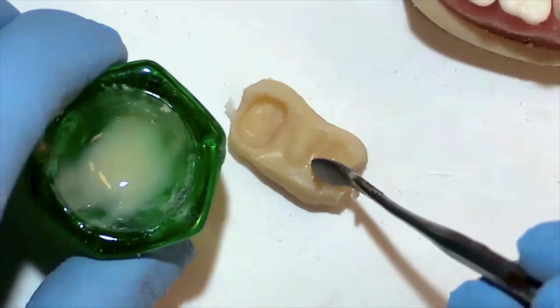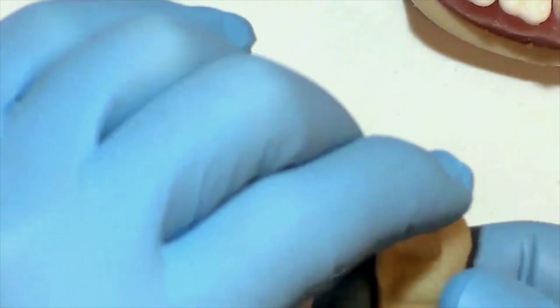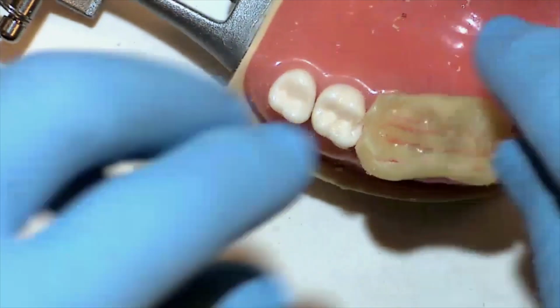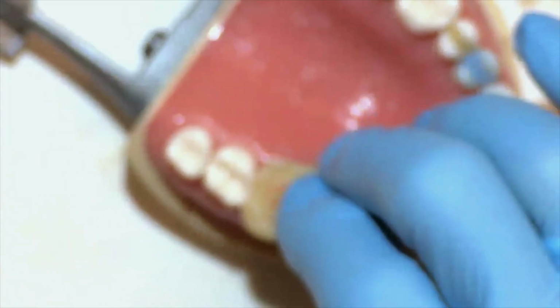We'll place that into the intaglio of the premolar. We also want to make sure we're still lubricated on there. If it hasn't worn off, we want to replace some of that Vaseline. Now we'll close it down on the articulator. See some of it exuding on the inner side.